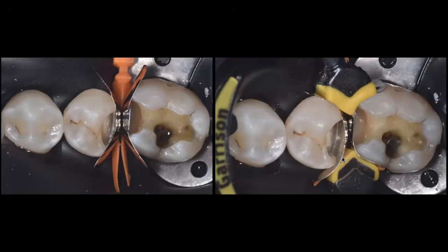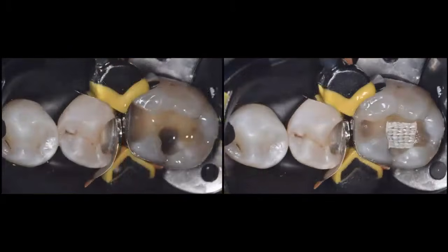So what did I decide to do clinically? I did not remove the ring. I decided to restore one of these boxes at a time, because I knew that if I did them both at the same time, I was going to have a lot of excess towards the lingual. So I'm going to start by restoring the first molar and the proximal contact on that first molar.